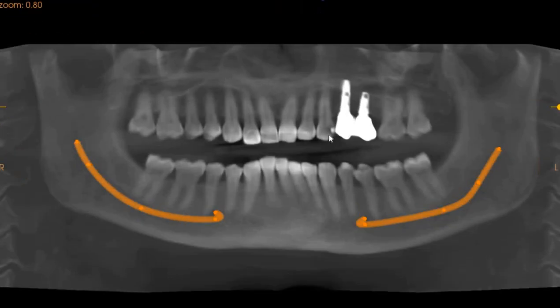On the panoramic view, we can see that tooth 3 has a carious lesion on the distal aspect and the palatal aspect.